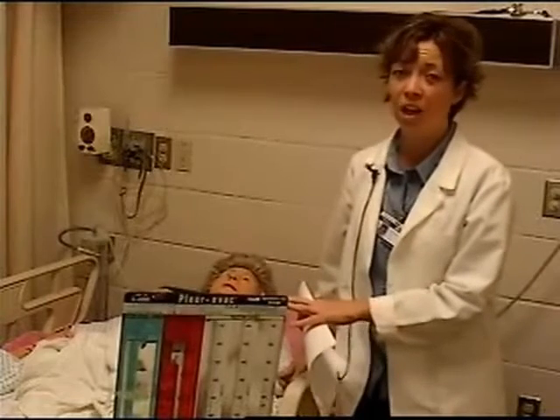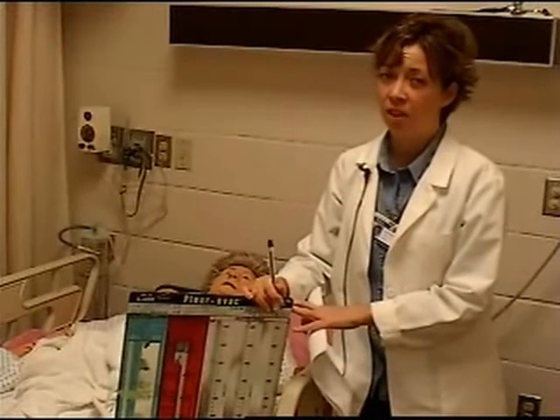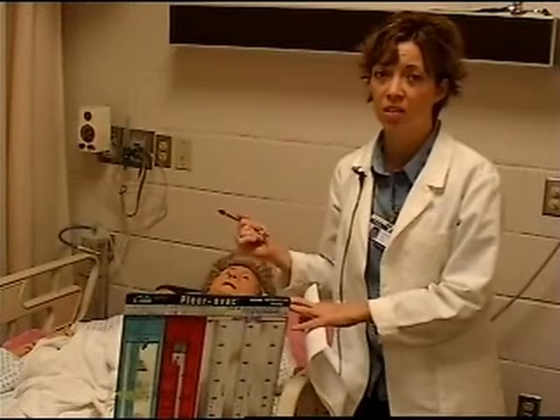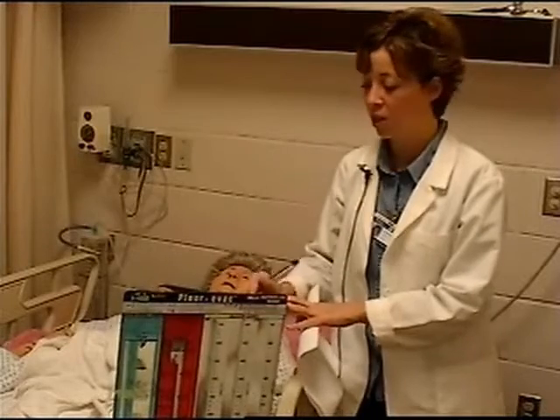These chest tubes are not comfortable for the patient, and pain management is huge. Recommendation is IV versus IM for pain management. Some patients receive PCAs, but you need to continuously be assessing pain management with that patient.